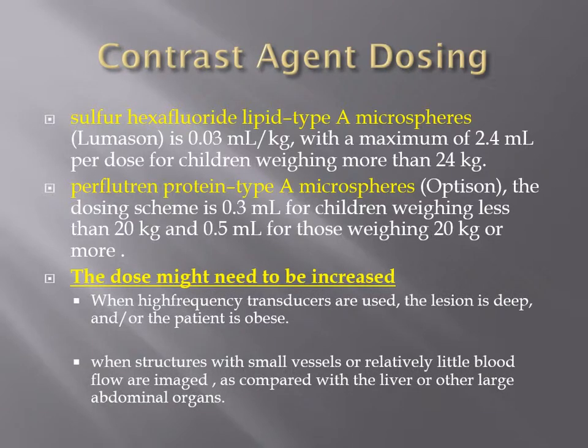Sometimes we need to increase the dose when we are using high frequency transducers, where the lesion is too deep, or if the patient is obese. Also, sometimes with structures with small vessels and relatively little blood flow inside solid lesions compared to the rest of the liver, we need to increase the dose.